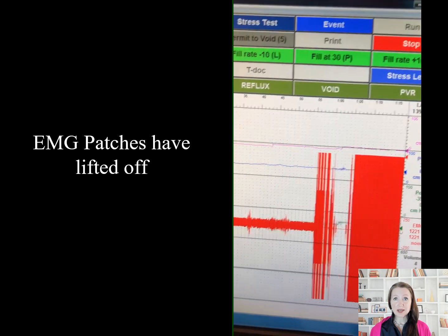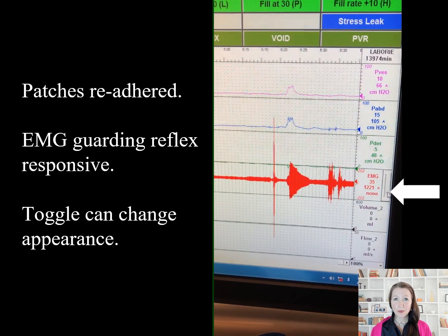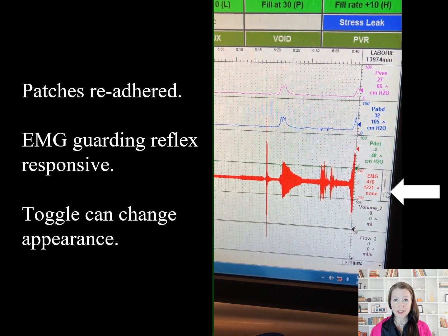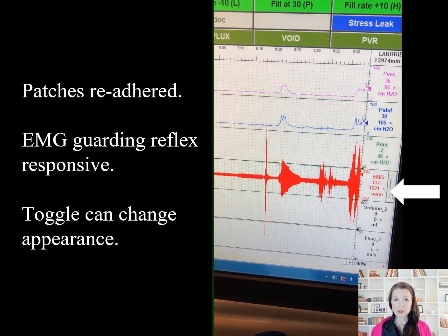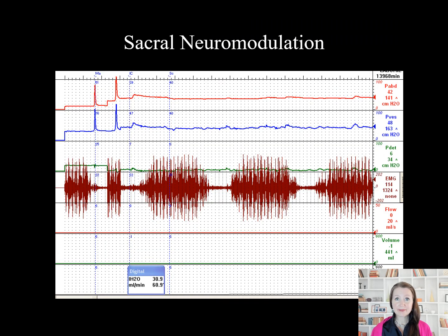Here the EMG patches have lifted off the skin surface, introducing artifact. Once the patches are manually re-adhered, the EMG guarding reflex is responsive. There is a small toggle to the right of the EMG row which allows alteration of the visual appearance of the EMG on the line. This is the appearance of a sacral nerve stimulator creating artifact in the EMG.